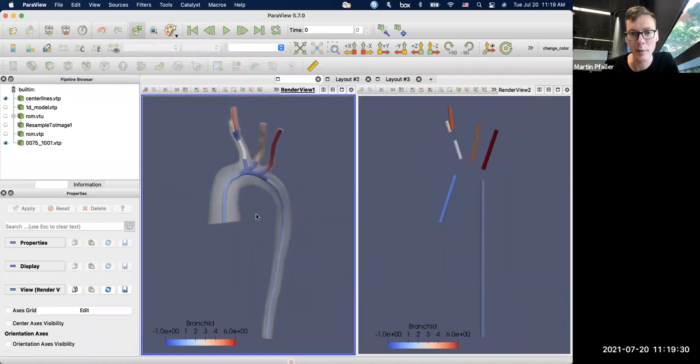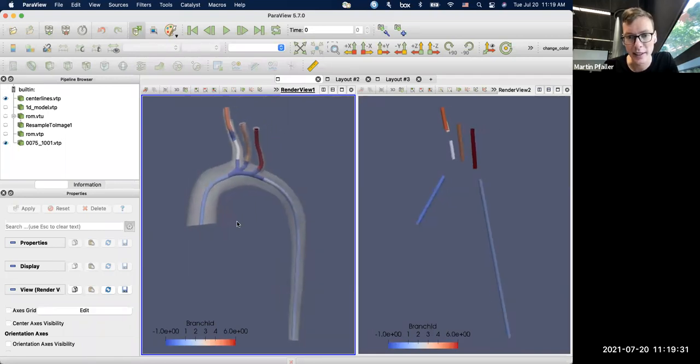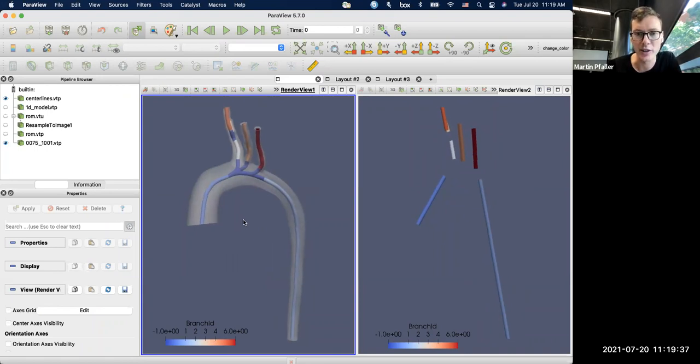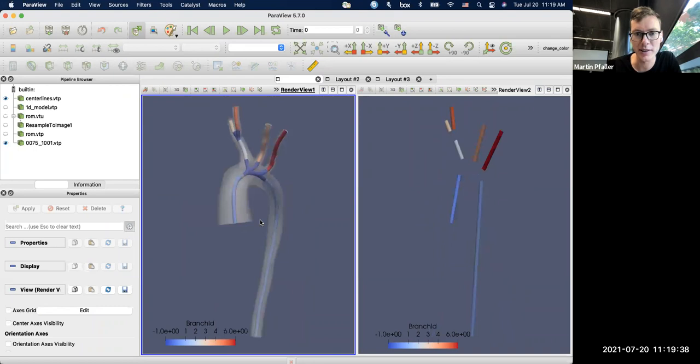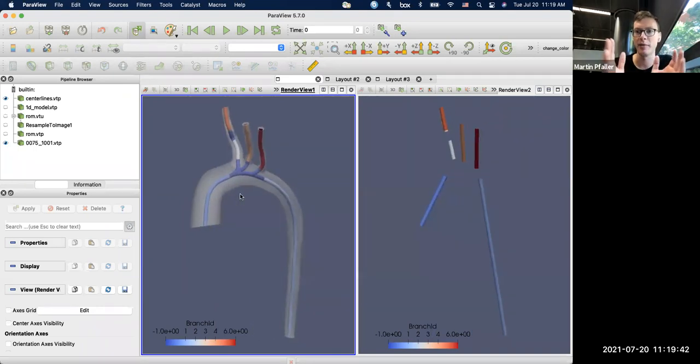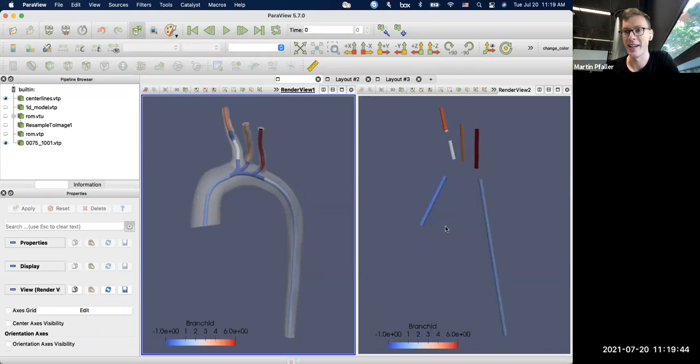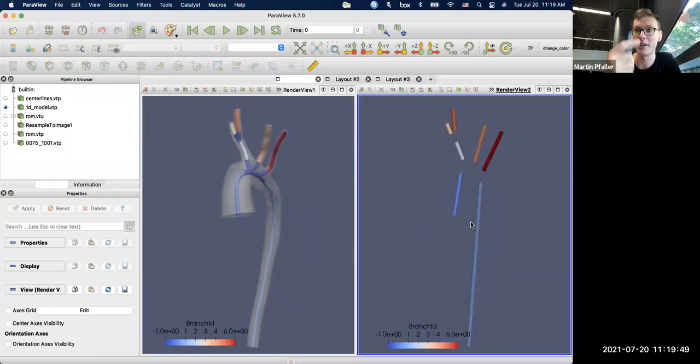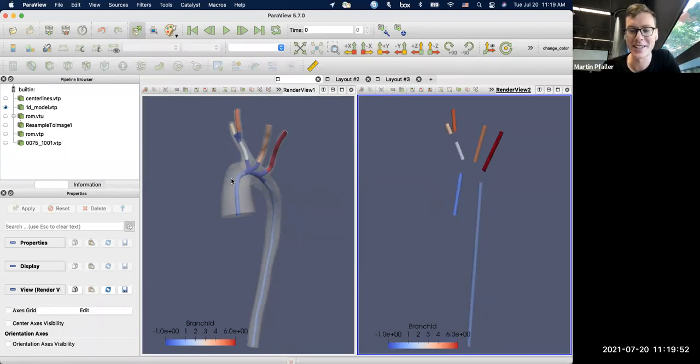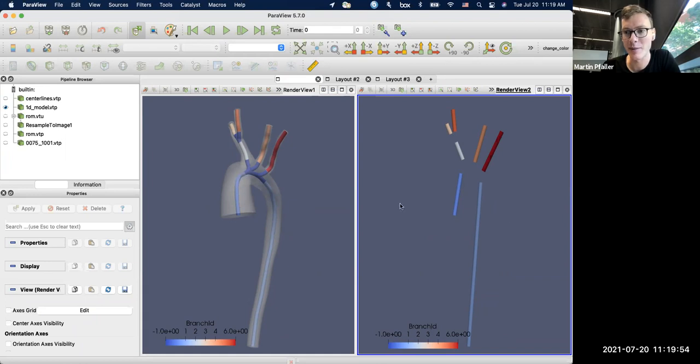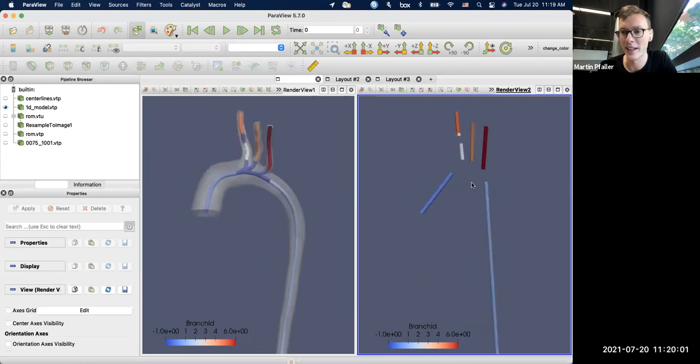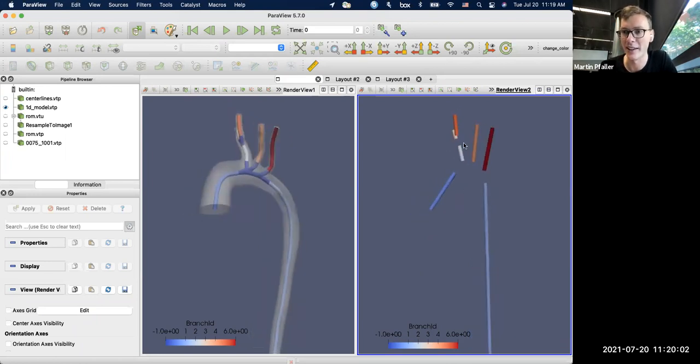So what SimVascular is doing in the background is extracting this centerline that you see here on the left. You can see the 3D model and the centerline geometry. And what we do in the background is we split up the model into branches and junctions. So you see two junctions in blue and in between the vessel branches. And the branches are the parts that we model with the 1D or 0D model.